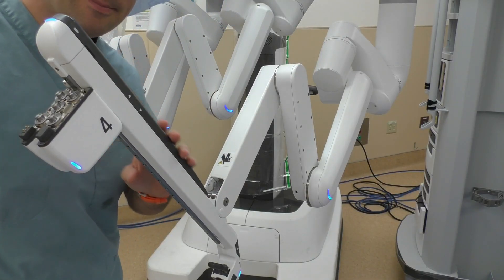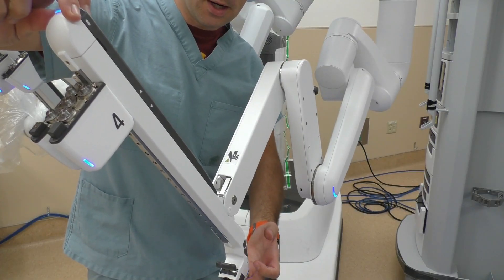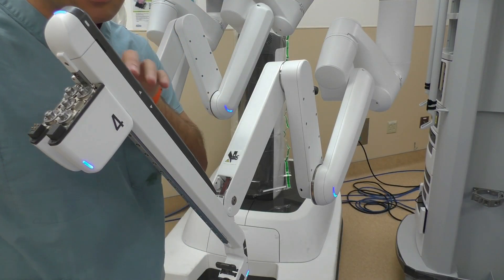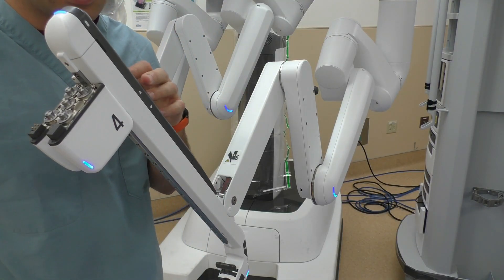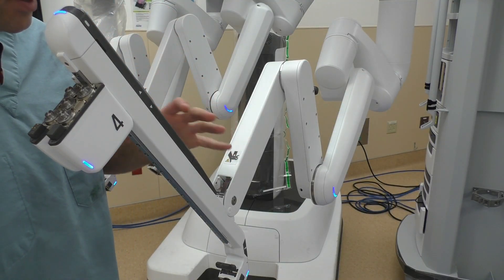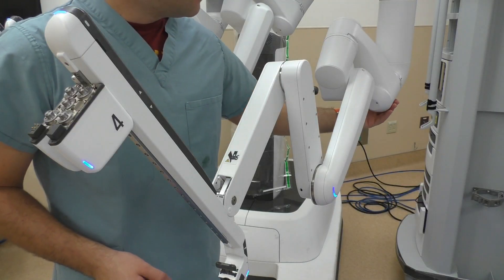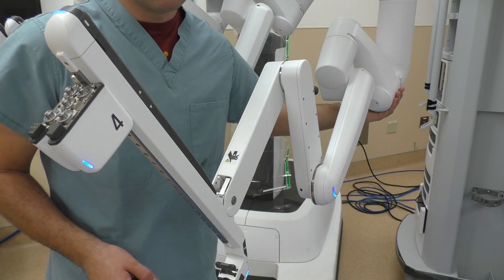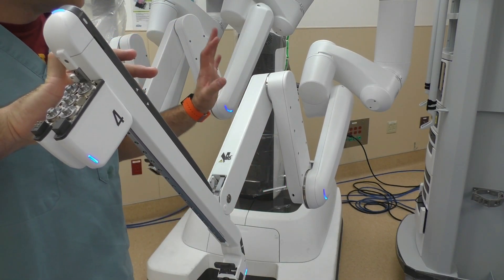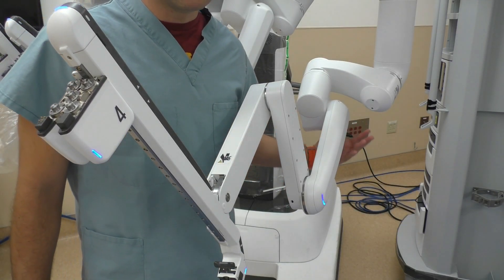I've got one more button to talk about on this arm — it's located on the back side. We have our two buttons here, but there's also a button directly on the back side of the arm. This button is specifically for patient clearance. After you dock your robot and have all your instruments in place and the surgeon is working the case, if you notice the arms are getting close to the patient, you can use this patient clearance button to move an arm out of the way to ensure it's not going to harm the patient.